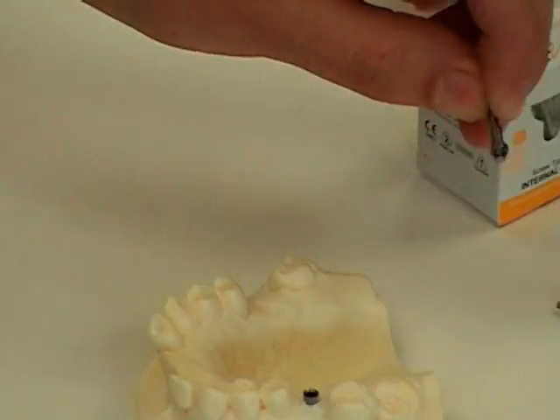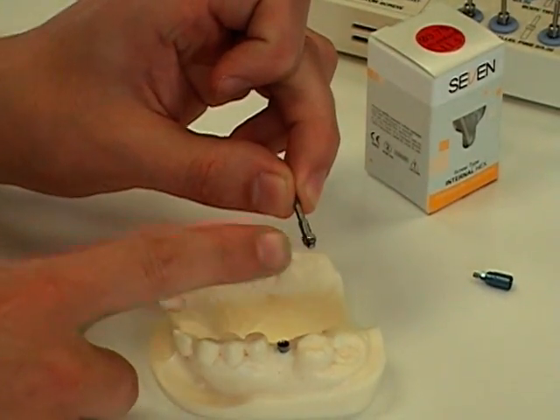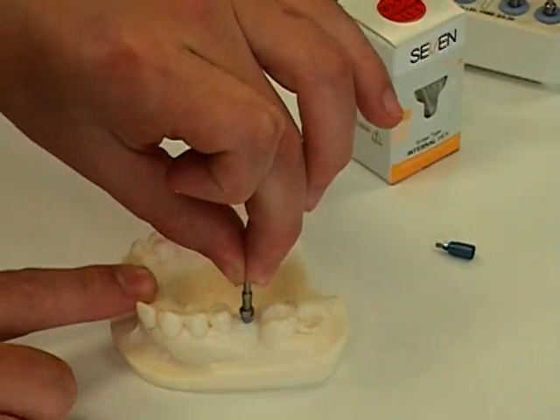We're going to show the direct insert tool that goes into the handpiece. As you can see, the bottom of it has the same size hex as the implant itself, so it will go right into the body of the implant.